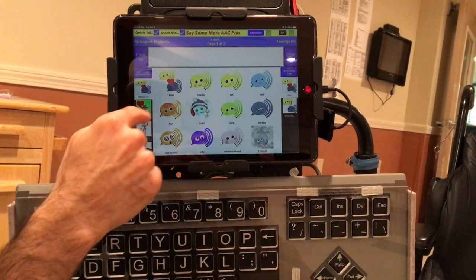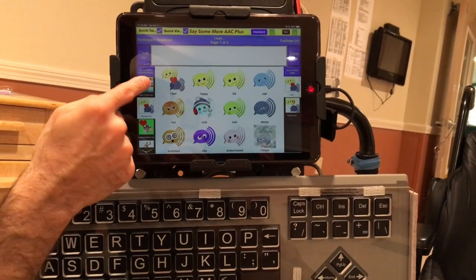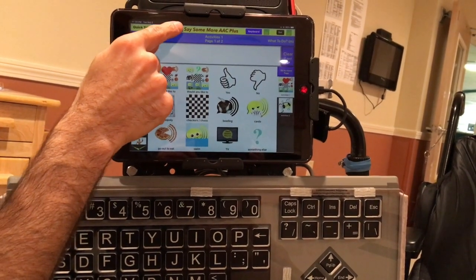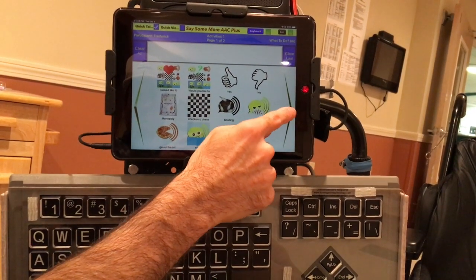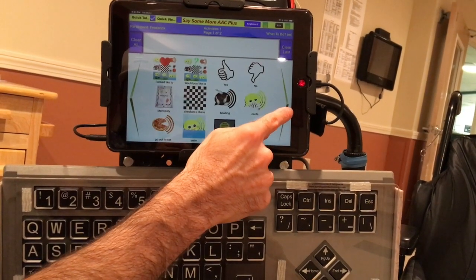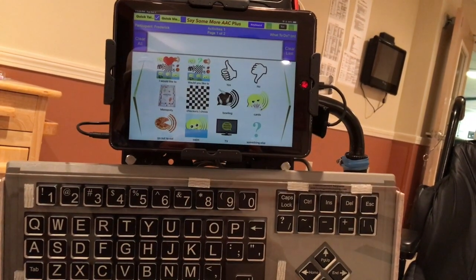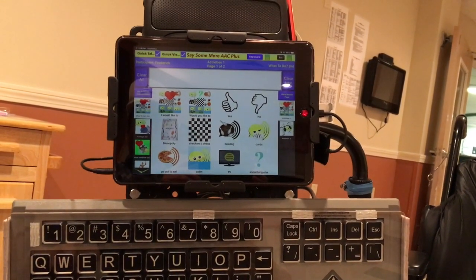If these icons on the side get a little bit too confusing, you can stick with just a single conversation, for example, and there's a little checkbox here that says Quick View. If I uncheck Quick View, all the stuff on the side goes away, and we are just in that conversation. It's going back and forth between the first page and the second page. If a conversation had more than 2 pages, it would scroll through multiple pages. But put the Quick View back on if you want to switch to other conversations.